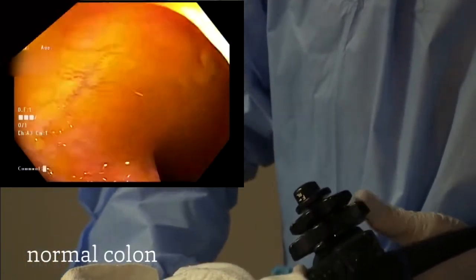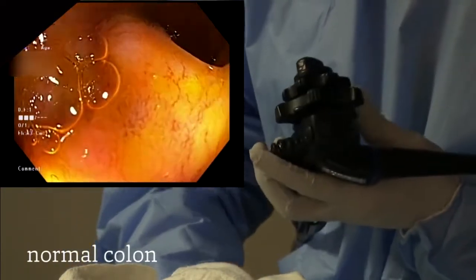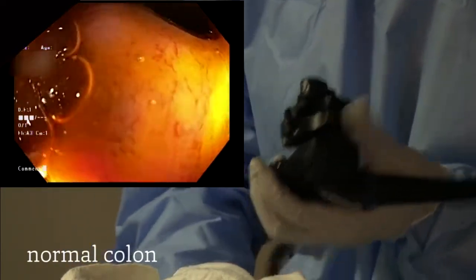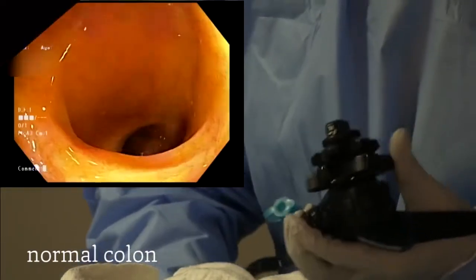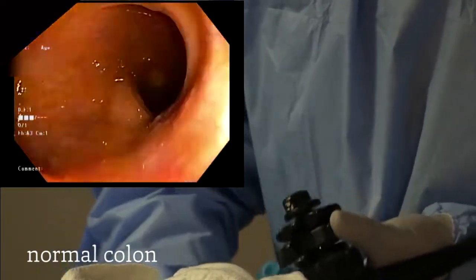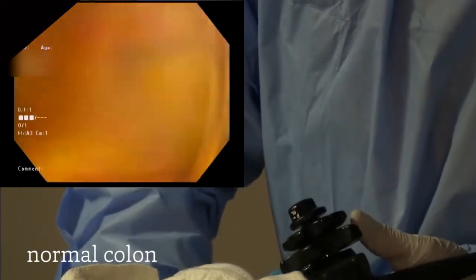We are now in the small intestine. You will notice a difference in the mucosa of the small intestine — there are finger-like projections called villi that line the small intestine. We could go further in the small intestine, but for the purpose of this exam, our focus is the colon. And so we're now back into the cecum.